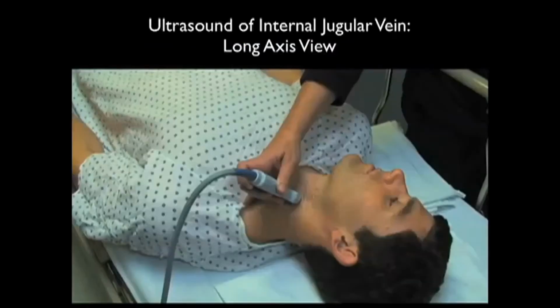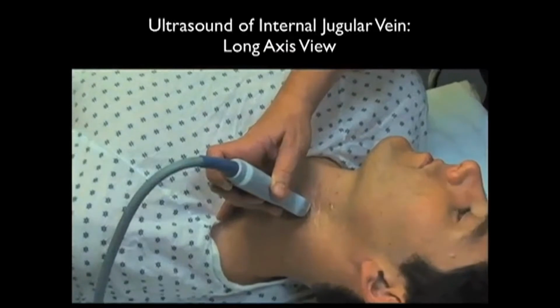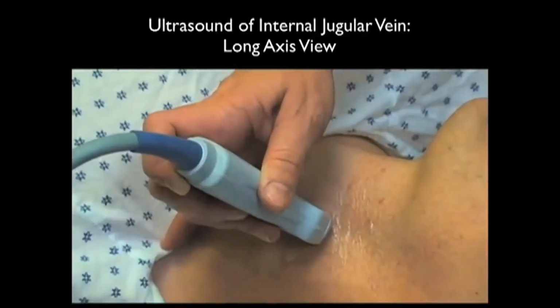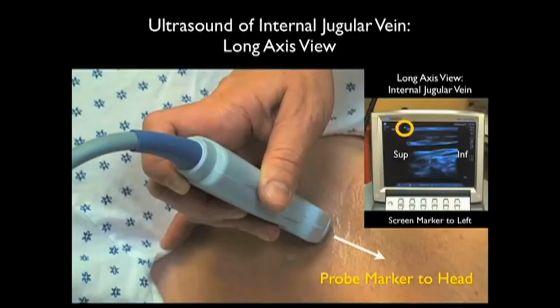Here's the high-frequency probe placed in a longitudinal, or long axis, manner on the patient's neck. Notice here that it's running along the course of the internal jugular vein as it runs up and down the patient's neck. By convention, I like to have the probe marker towards the patient's head. Therefore, I know where it lines up on the ultrasound screen. Notice here, as the screen indicator dot is towards the left, that superior on the internal jugular vein will be located towards the left of the screen, and inferior will be located towards the right of the screen.